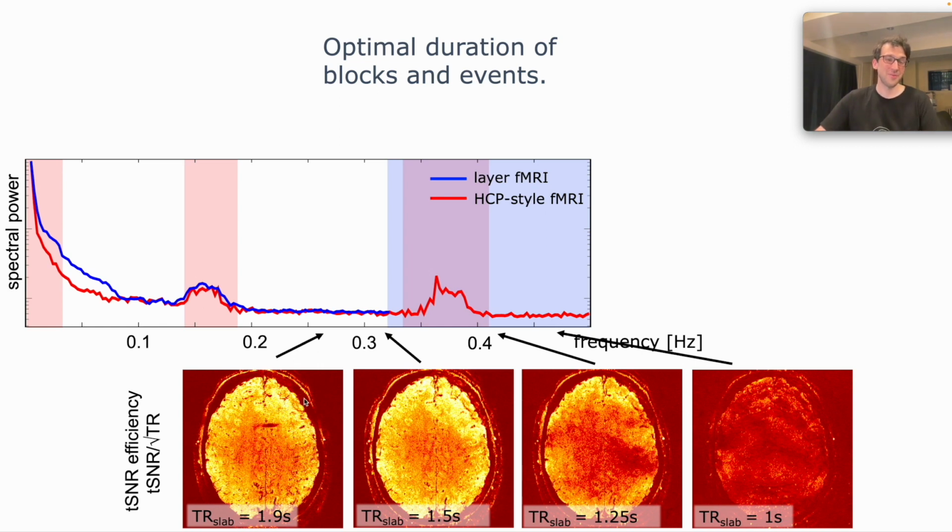And if you are not doing less than maybe GRAPPA 2 or 3, then you're not really gaining a lot by going even slower for a given duration. So usually just going slower helps a lot, not going fast. So you have more sensitivity.